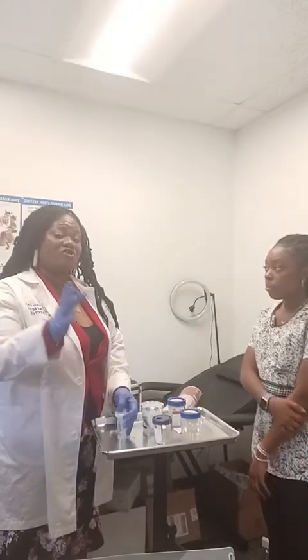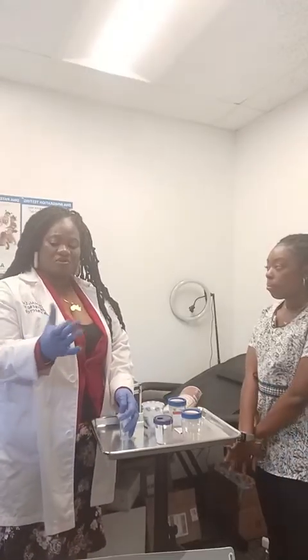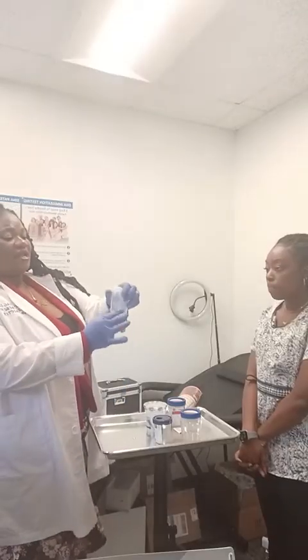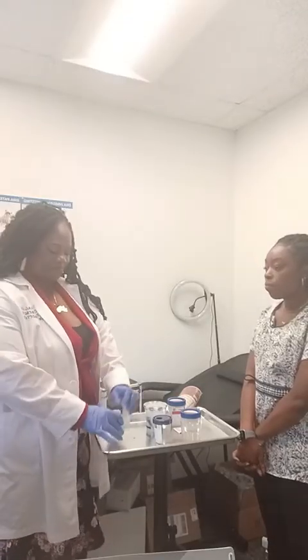As I always say, when you take my course, I recommend you do more, because you want to avoid spill. Should you have spill, by the time the specimen gets to the lab, we still have enough. You don't want your test to be a fatal flaw. You want to have enough specimen. So my recommendation is for you to at least get 50 milliliters, and always do extra.